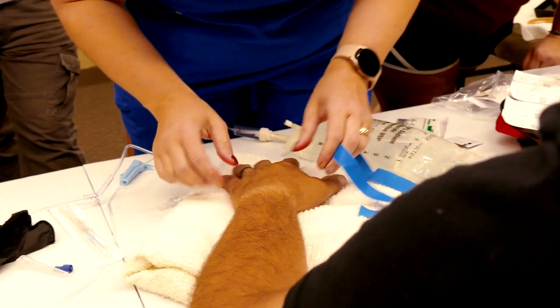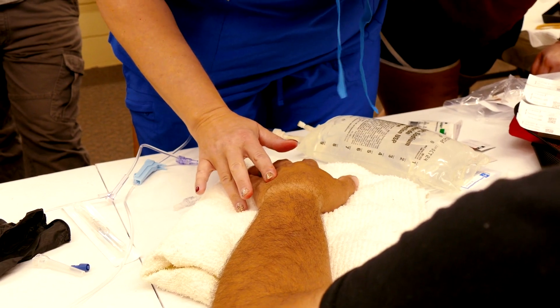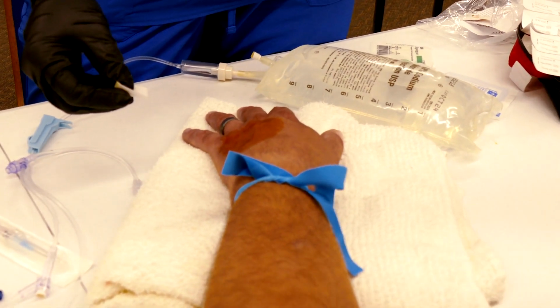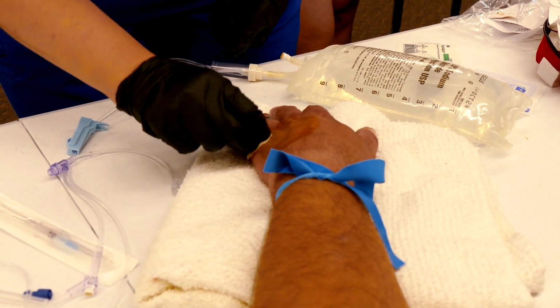Should I spec it out now already? If you can do it without the tourniquet, that's great. But there's a small subset that the tourniquet makes it worse. I don't want to speak for this gentleman here, but my guess is that for the most part, try and have somebody that's done one before or is familiar with it, just to have that coaching. If you're alone and it has to happen, I'm guessing use your best judgment. If you see it and you feel comfortable, try it. Okay. So if they need the fluids in a situation, it's the 15 steps before it that I don't want to mess with. But once you get doing it more often, it really does help.